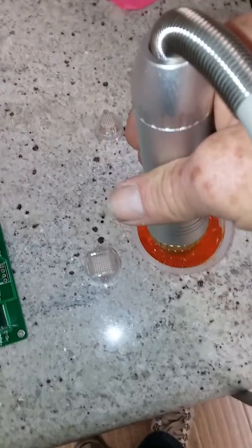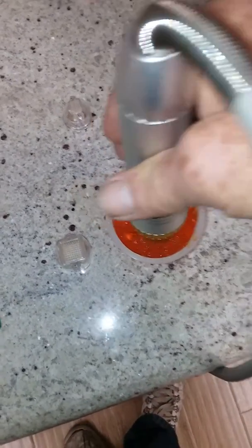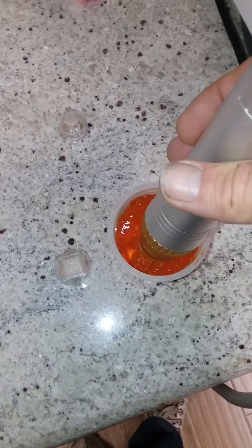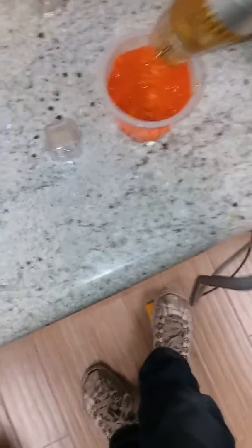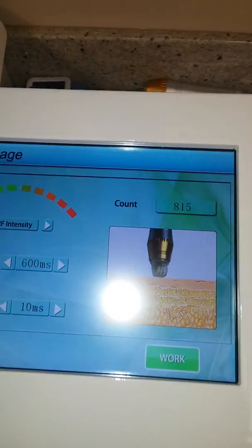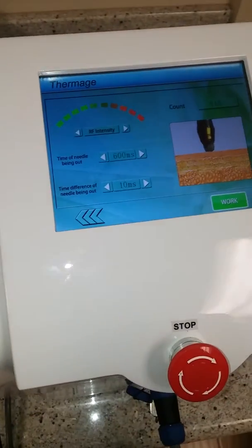Creating immense heat with RF and poking the jello with 81 needles, melting the cold jello — there's the crater it left. Anyways, this device is used for cosmetic surgeries.